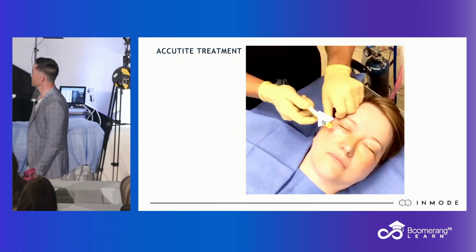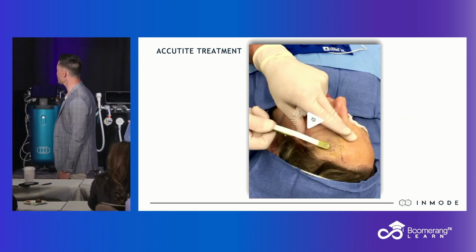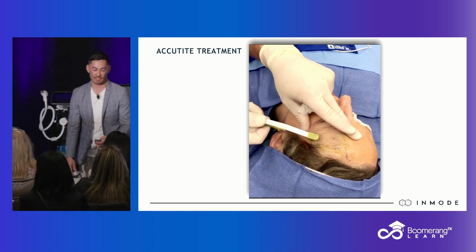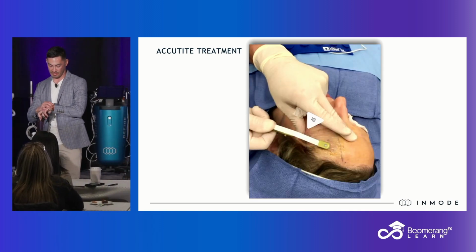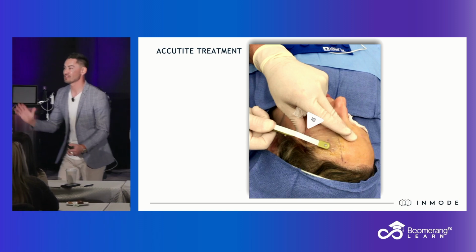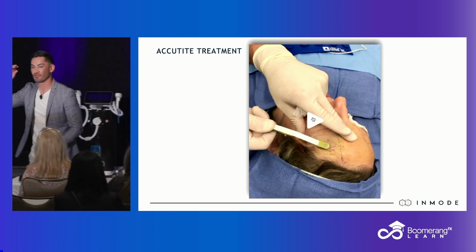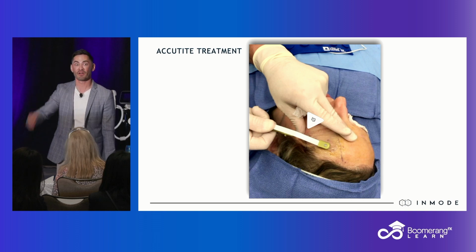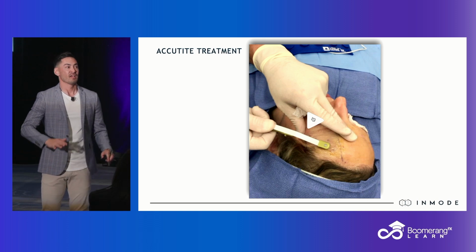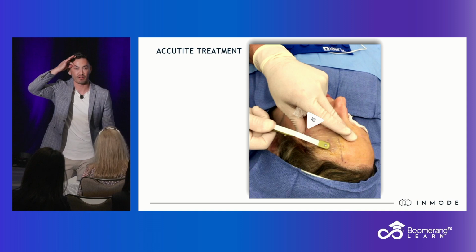This might be me doing my office manager's lower lids, under local, just a little bit of injection. This is lateral brow. It's awesome, awesome, awesome. Now, time out, friends. Sorry, knees, I gotta tell them this. This is important. This is lateral brow. Aesthetics, we're in aesthetics. Detail matters. This is not the full brow. If you guys treat the full brow, you're going to elevate the full brow, and then everyone's going to walk around looking like they're surprised. That's not sexy. Aesthetics, we want sexy. Lateral brow. So how do we find lateral brow? That's the outside. That's what's attractive.